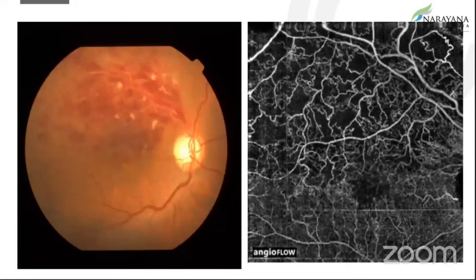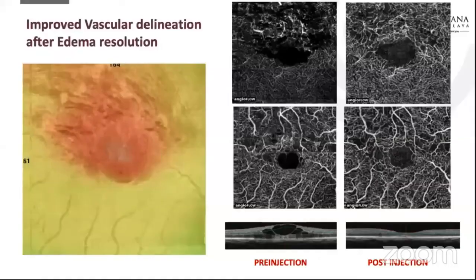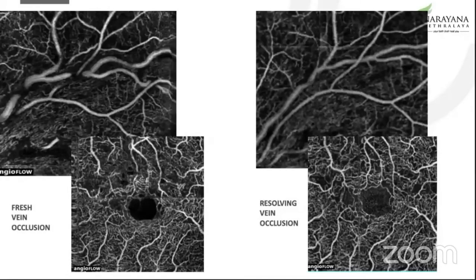This is another patient — again, the superficial and the deep — and you can see the capillary dropout areas. One important thing to remember in patients with edema is that it can obscure the vasculature; it does not necessarily mean that there is loss of vasculature. You can see that the vessels are now seen quite well after injection once the edema has started resolving. We need to be clear that not everything that's not seen is actually absent — with resolution of the edema, the vasculature could be seen back again, improving the prognosis.